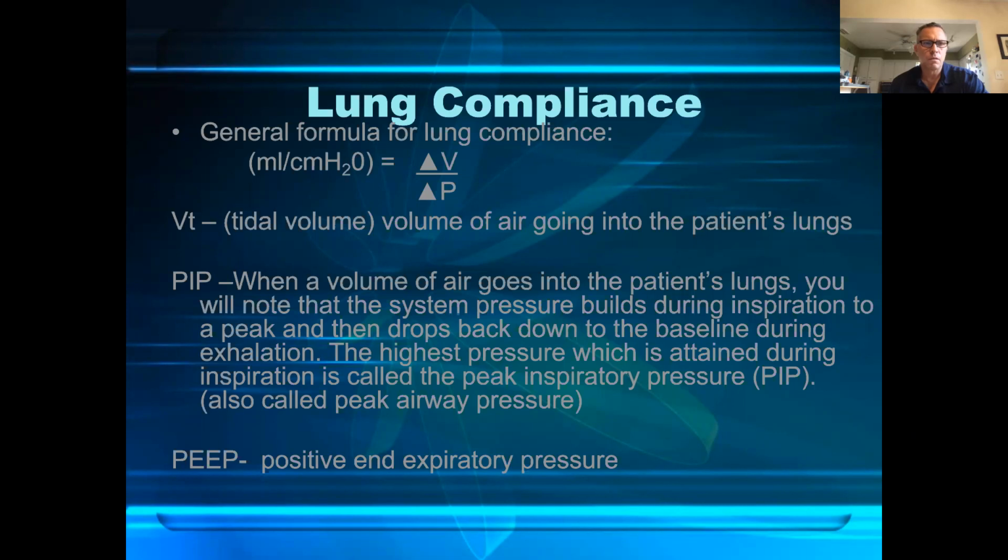The change in volume would just be, when the lungs were empty and then you fill up the lungs with the volume of air, that's considered the change in volume. And that's what the delta is for. For the pressure, it's the change in pressure. So we would find the baseline pressure and then find the pressure at the peak of the breath. And that would be the delta or the change in pressure.